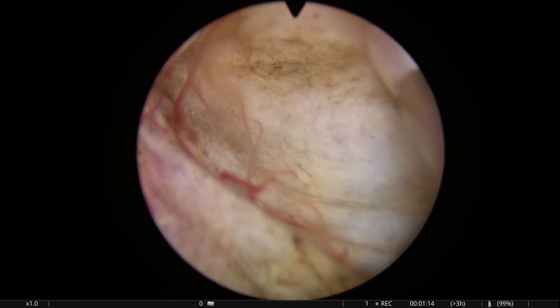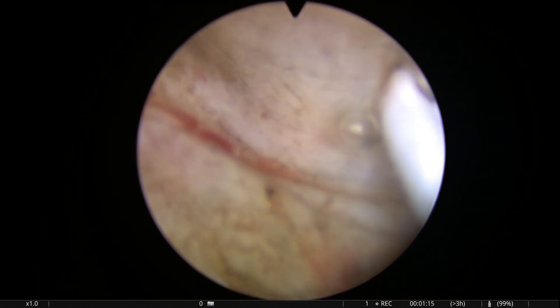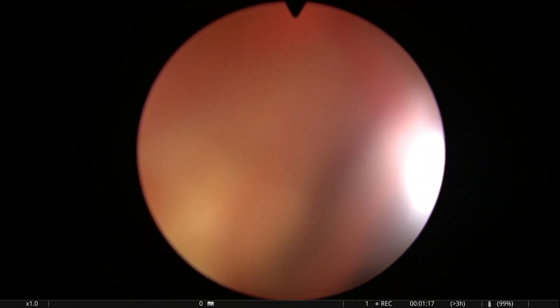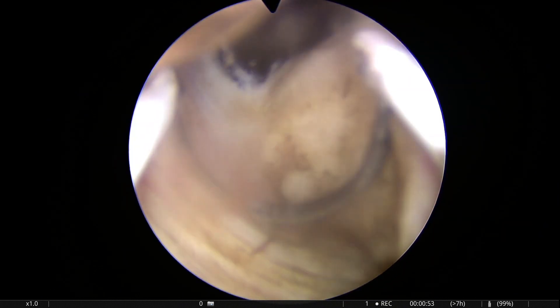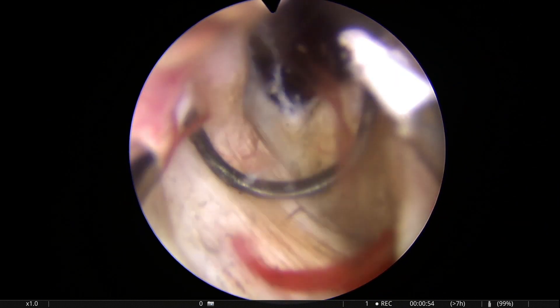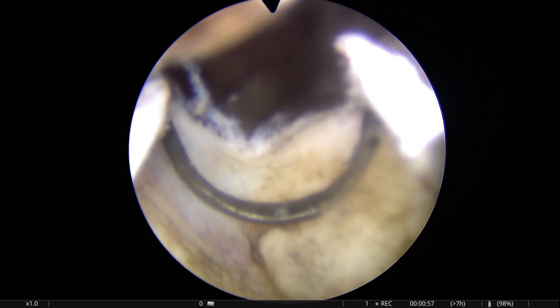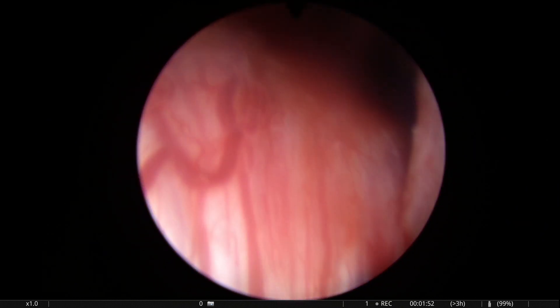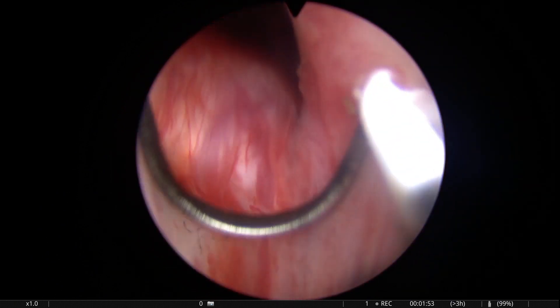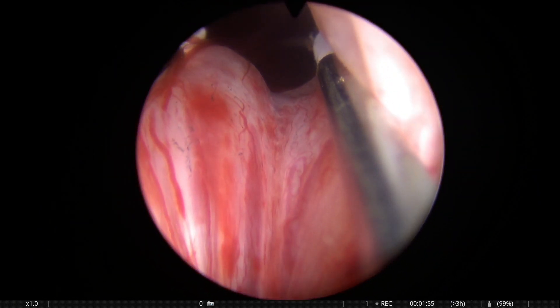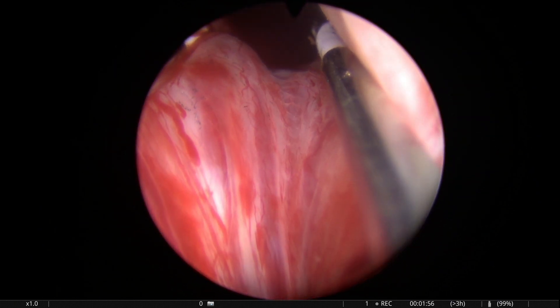Second, when you deepen the groove up to the level of the muscle fibers of the bladder neck, you can go into the bladder easily and can see the position of the ureteric orifice.